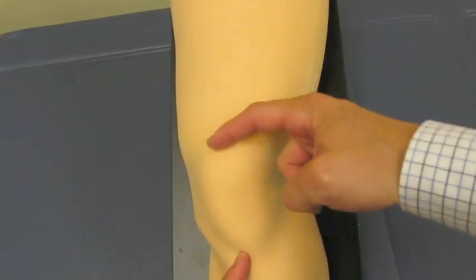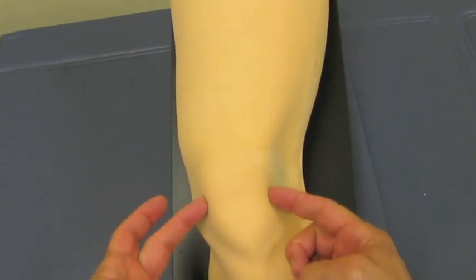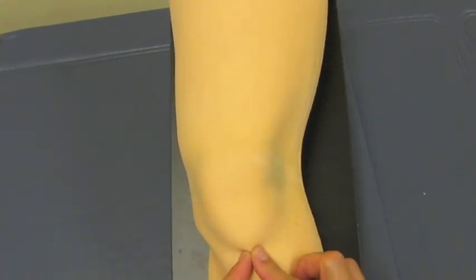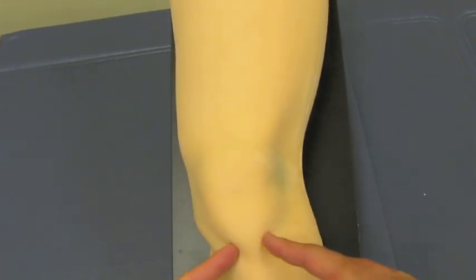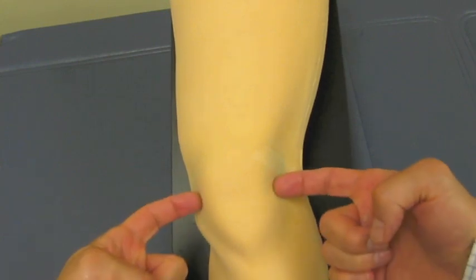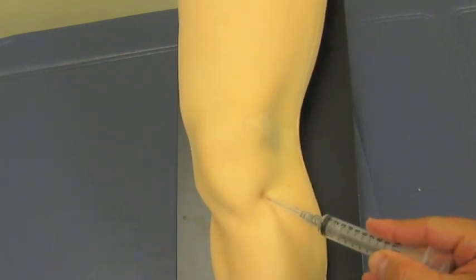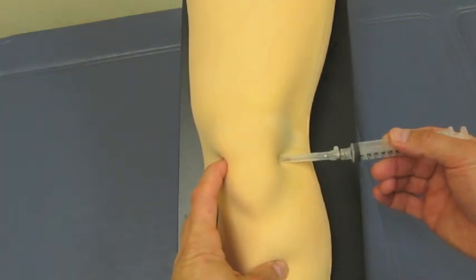First, it's important to identify the superior, inferior, medial and lateral borders of the patella, as well as the femoral condyles and joint line. There are 6 possible points of entry or portals: 2 superior, 2 inferior, and 2 mid-patellar. For example, this will be the portal for a lateral inferior approach, and this will be a lateral mid-patellar.